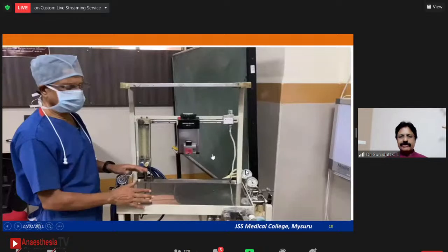Now I'll just show you a video, because though they are called oxygen fail-safe valves, they are not actually fail-safe. It's a misnomer, and they are actually replacing the master-slave regulators and almost function like a master-slave regulator. Sometimes you may be asked to demonstrate whether the master-slave regulator is working or not in the older machines, and the fail-safe valves also have the same mechanism.